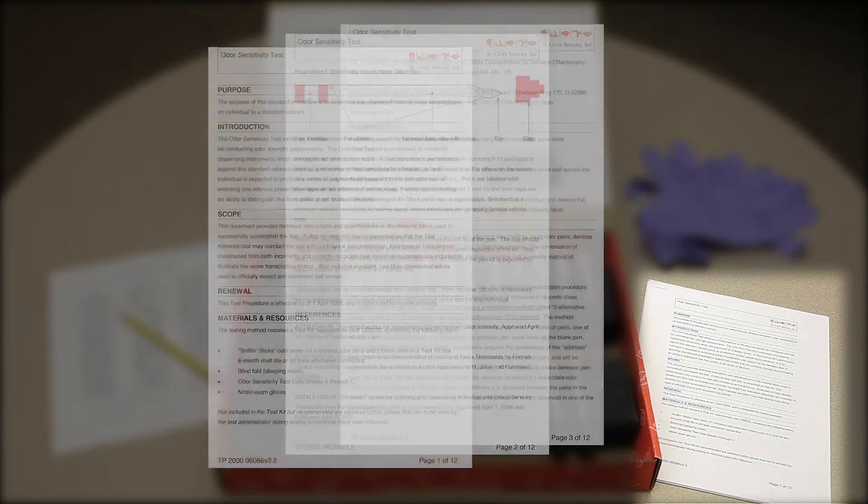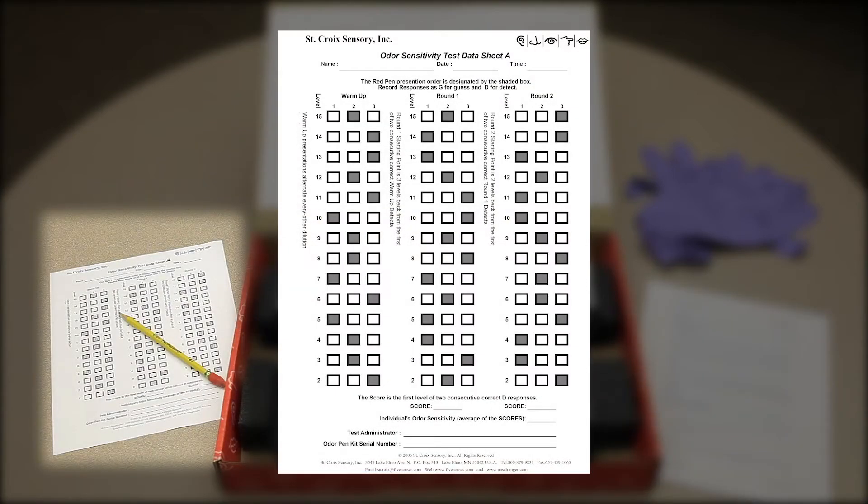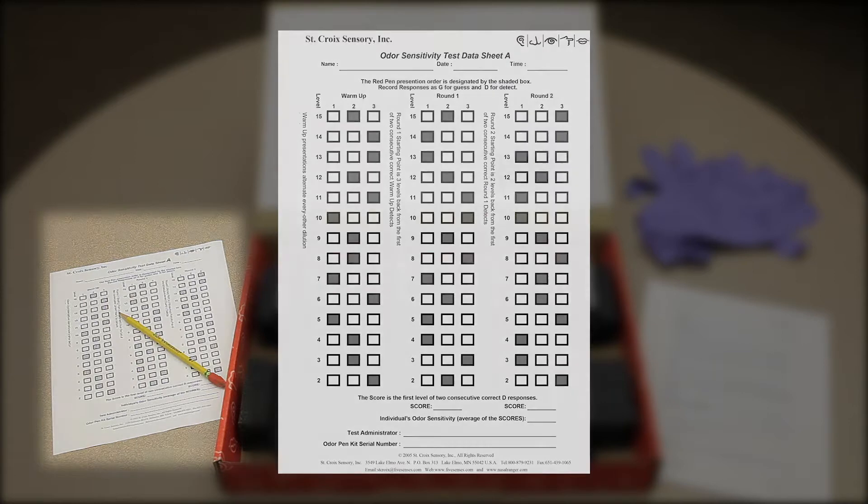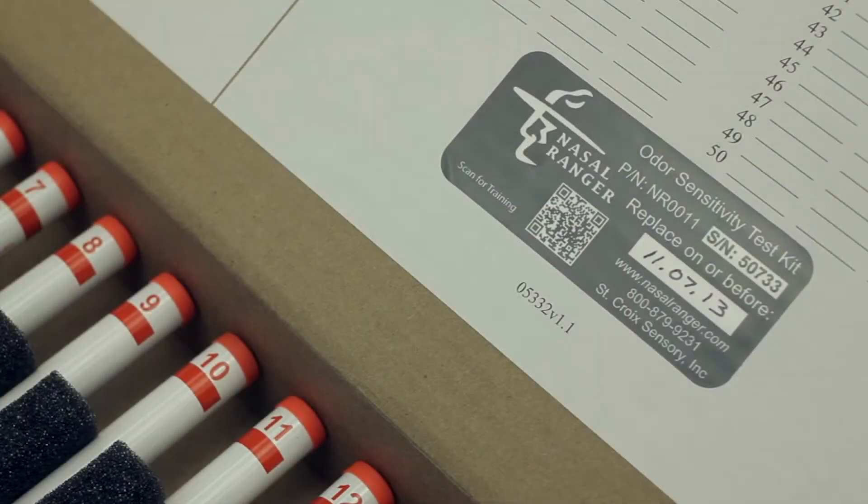The test procedure contains three data sheets, versions A, B, and C with different test sequences, a test record for documenting each test, and finally, the kit serial number with the test expiration date.